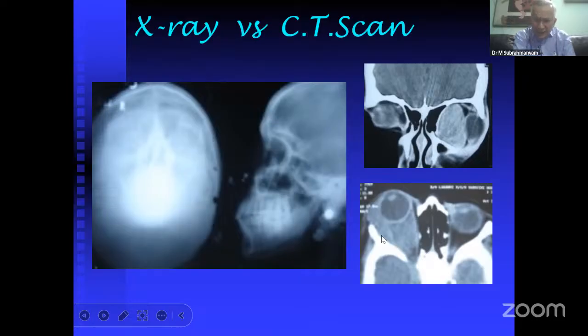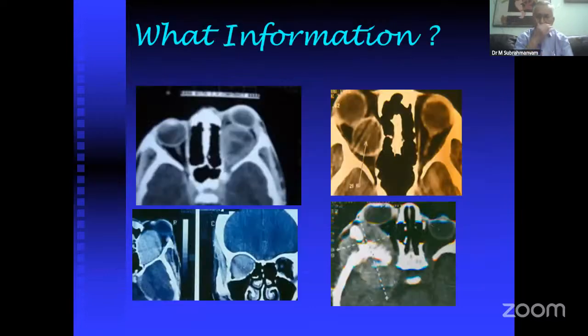And there's a minimal erosion in the lateral wall and a little excavation. Most probably it's a fungal granuloma. The eyeball contour is maintained. If the eyeball contour is maintained, it is usually either a lymphoma, adenoid cystic carcinoma, or a fungal granuloma. One of the three it should be.